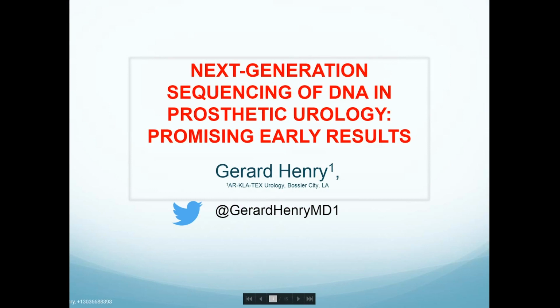Hi, this is E. David Crawford, Editor-in-Chief of Grand Rounds in Urology. Over the years, we have relied on standard agar plate culture and sensitivities to determine the presence or absence of infection. Most recently, there's been a new way to look at that, which involves next-generation sequencing.